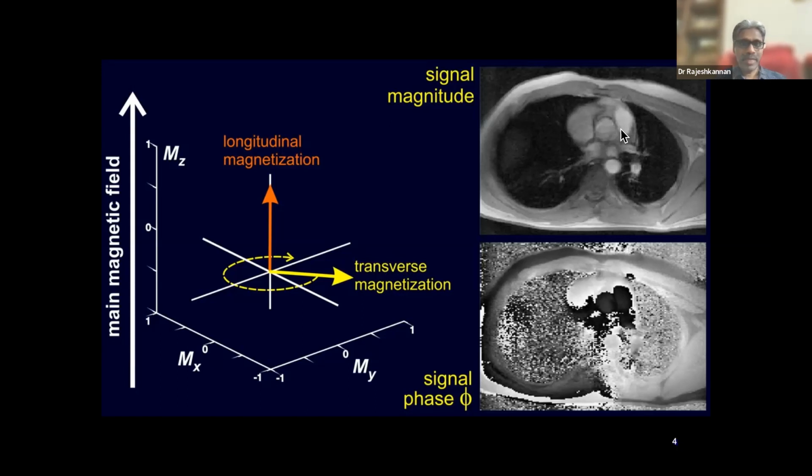Whether it appears brighter or darker basically depends on the transverse magnetization and its signal amplitude. Also, during the Fourier transformation after acquiring the data, we don't only get the final signal of each pixel; the data also represent the exact phase and frequency of each spin in the different pixels.